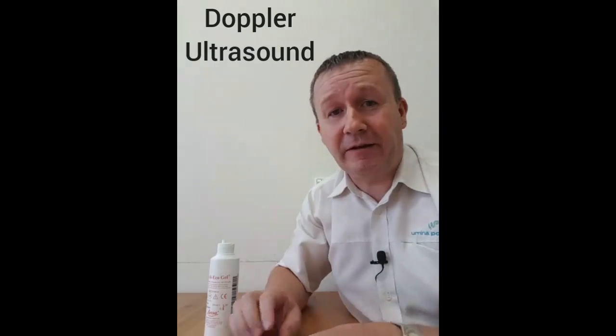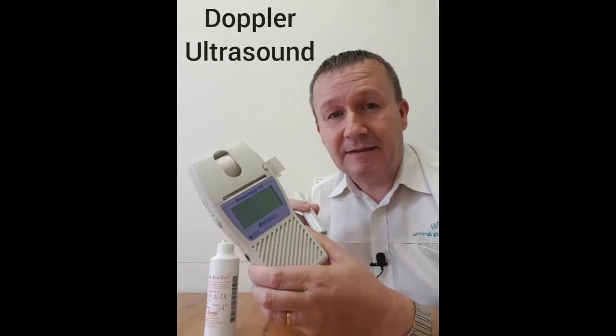Hi, Damien at Yamina Podiatry again. Welcome back to the coffee table where we've got some more of the equipment that we use every day here at Yamina. This is a Doppler.